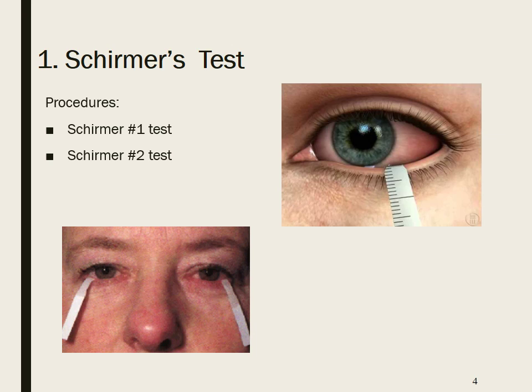ruler. Set up. Before removing the Schirmer strip from its cellophane wrap, fold the rounded end of the strip so there will be a crease at the notch. Remove the strip from the cellophane wrap, taking care not to touch the rounded end. Dim the room illumination and perform the test with the patient in the upright seated position.